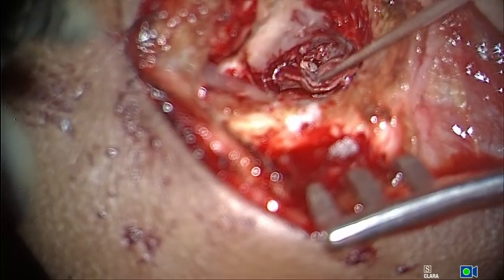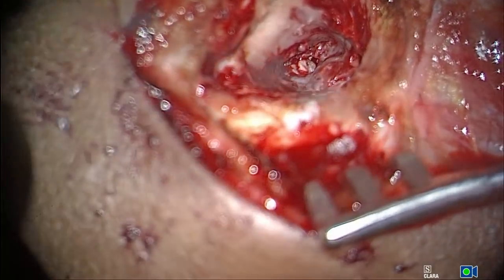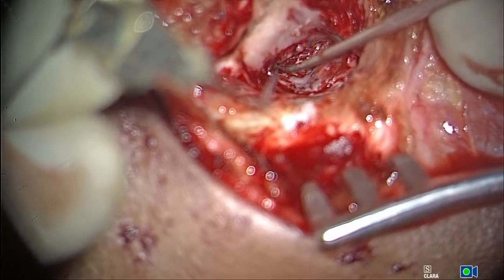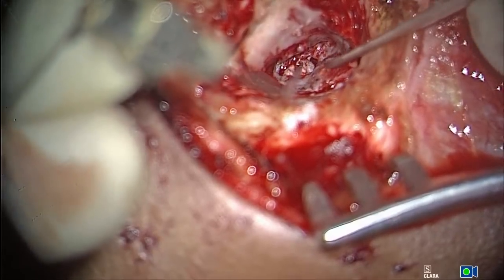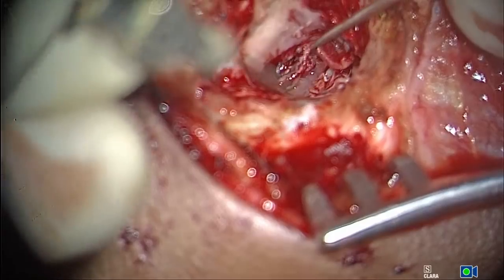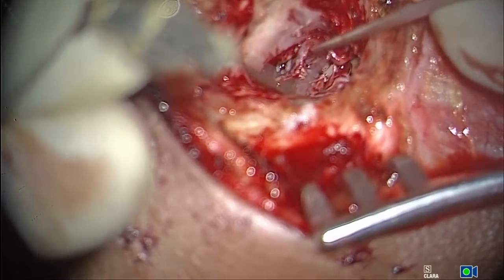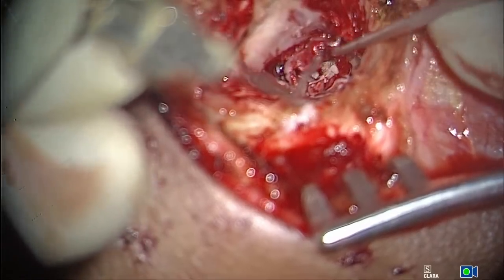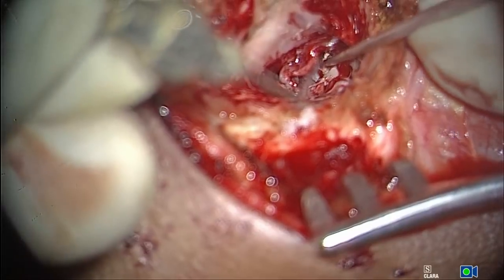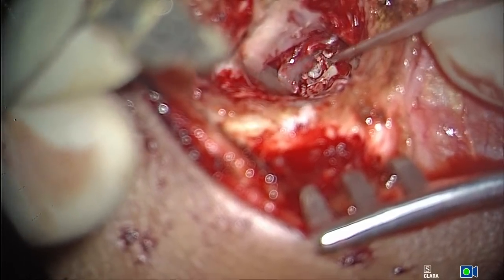One is, see that there is a little gaping between the graft here and the perforation. So what I'll do now is to lift that flap. See how I can manipulate that flap, the graft. I think these techniques are the most important for a good graft take. See how I'm raising it now.